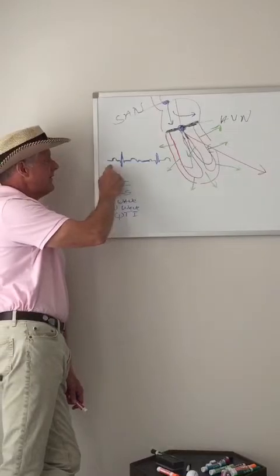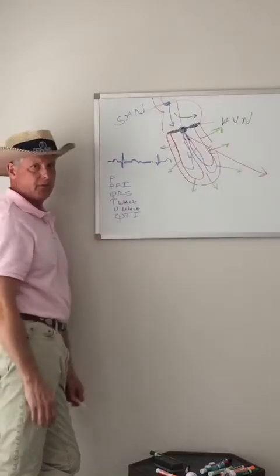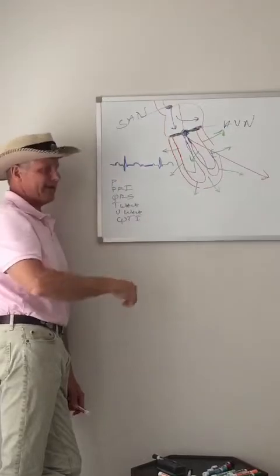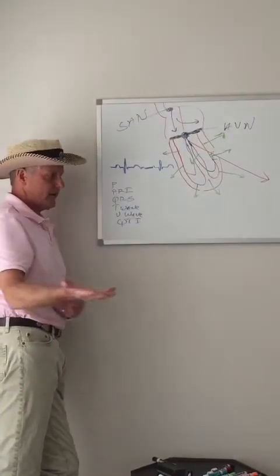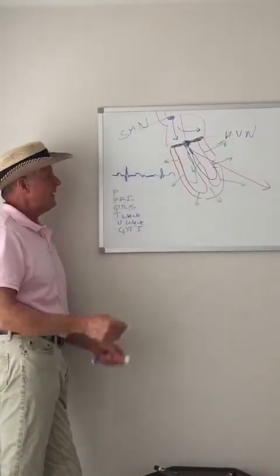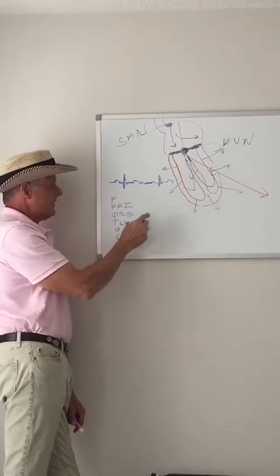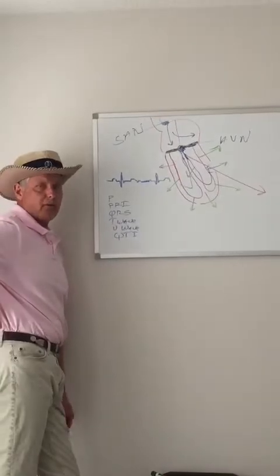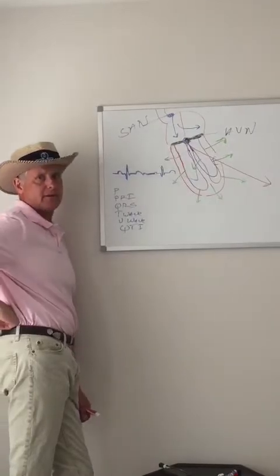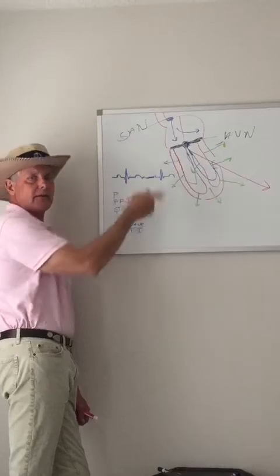So you have a P wave, then you have a QRS. The QRS represents ventricular depolarization, combined right ventricle and left ventricle, and you know QRS. Of course, it may not be QRS, but you guys know that. We call it the QRS anyway, even if it just looks like an R wave or an RS wave. Then there's a time delay, and you get this next wave called the T wave. Well, it's not really a depolarization. It is the electrical reflection of repolarization of the left ventricle. All right, and then sometimes after a T wave, you get another little blip.